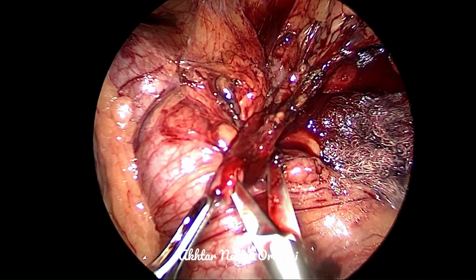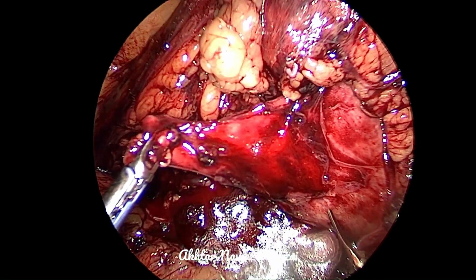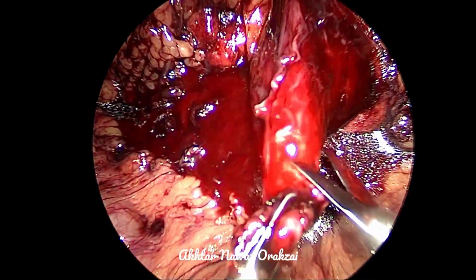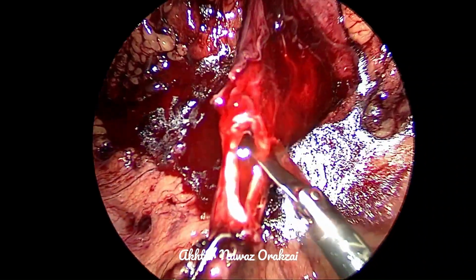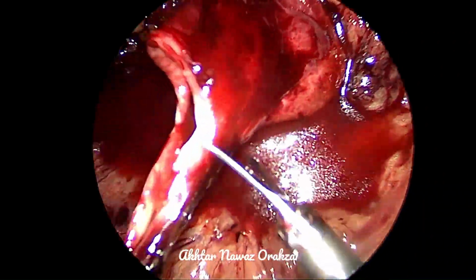And then we will spatulate the ureter for a good 2 to 2.5 centimeters, and then we'll cut the pelvis. Here, after cutting the pelvis, you can see that urine is pouring out, and the pelvis is thick-walled, which also confirms the diagnosis to be pelvic-ureteric junction obstruction.